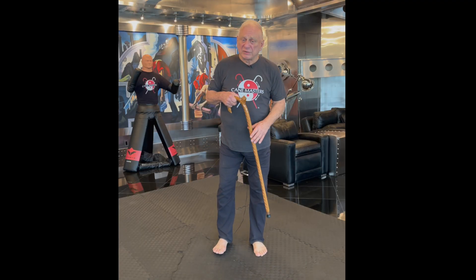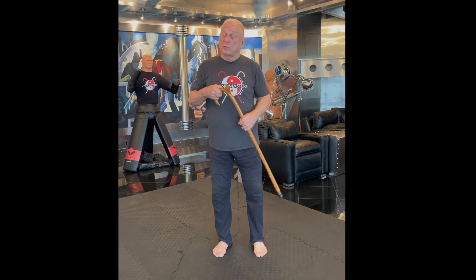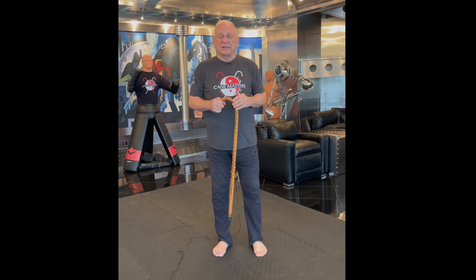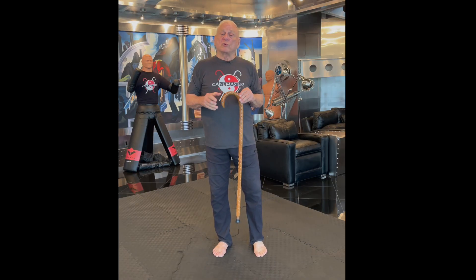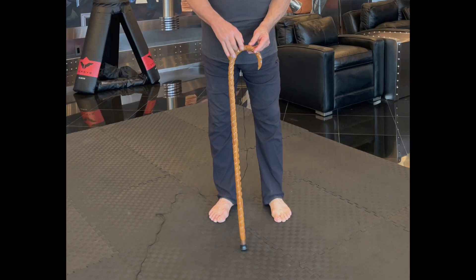I'm an engineer by training. In my experience and in our work here in the world of canes, we find that that is ergonomically incorrect — that you are far more efficient to use a cane with the horn forward.